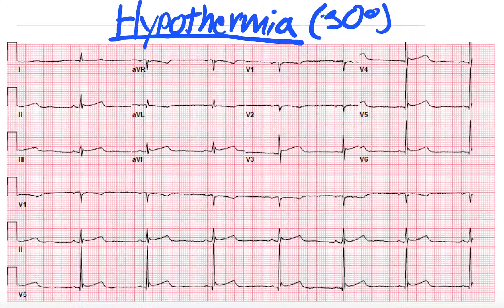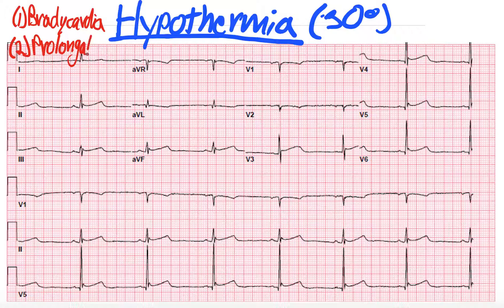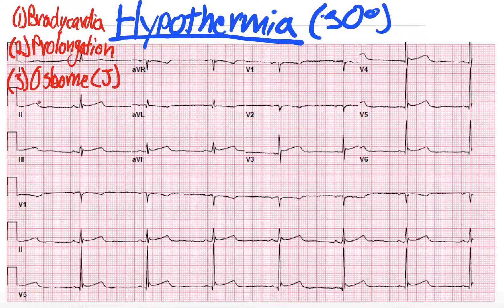When looking at EKGs of patients who are hypothermic, we look at a few things. I'm going to list them here to the left, and then we will talk about our EKG and each one. The first is bradycardia or brady dysrhythmias — these patients often have a slow ventricular and atrial rate, sometimes sinus bradycardia, sometimes slow afib. In addition to that, we often get prolongation of intervals: that can be the PR, QRS, or QT. And then the third — the one you hear most about — is Osborne waves, or elevated J points. For the sake of this discussion, we're going to focus on these three things.